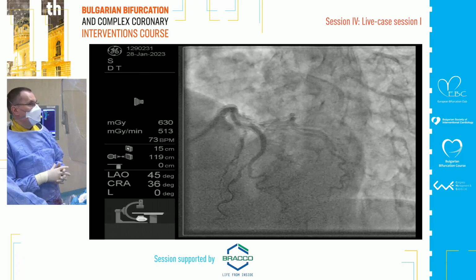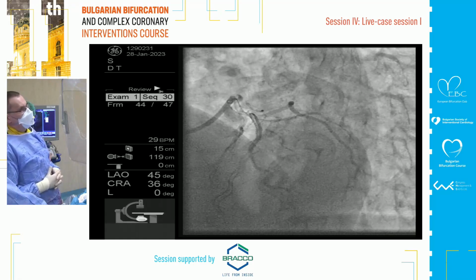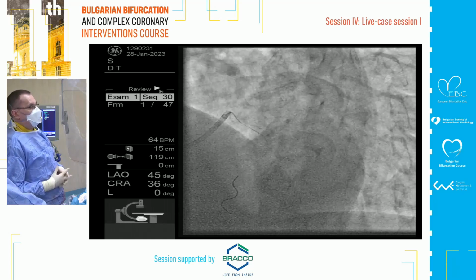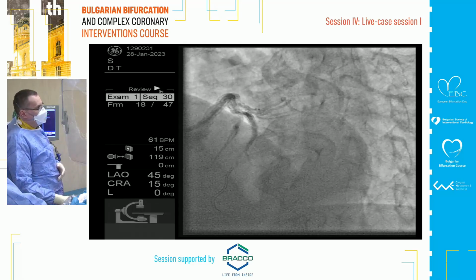So 3 plus 3, 6. 2/3 of 6 is 4. So the Finet formula gives 4.2, much easier than Murray's law. And even the HK law is worse. So this is something a normal interventional cardiologist can do, even me, in the cath lab.